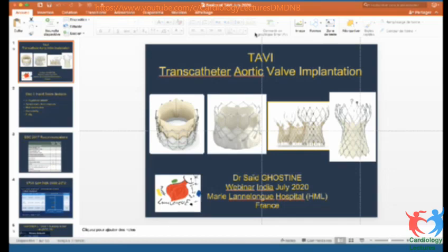And we still remember that even the previous day, when you showed us the case, you told us to measure everything, even just prior to the procedure, to do a mismatch case assessment. I didn't understand the last question, because I don't have a good connection. Yes, even before beginning the case, you have to check the CT another time and what you are doing.